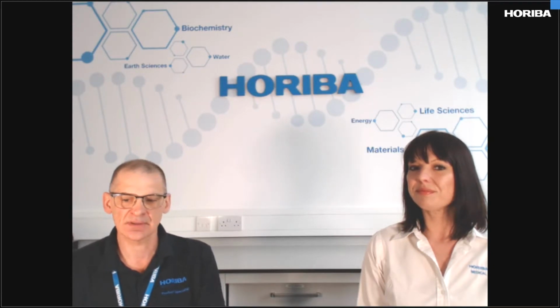Okay, yeah, well, Anna, it's literally hot off the press that for QSP v2, if you have a site license, you can now use that site license through a VPN, a virtual private network, which means that you don't have to be on that particular site's network, so you can be almost remote accessing into QSP. So that will enable more users to be able to connect using the site license.